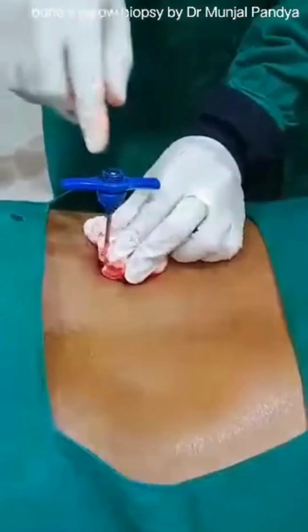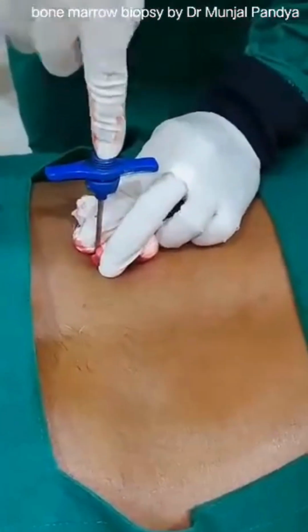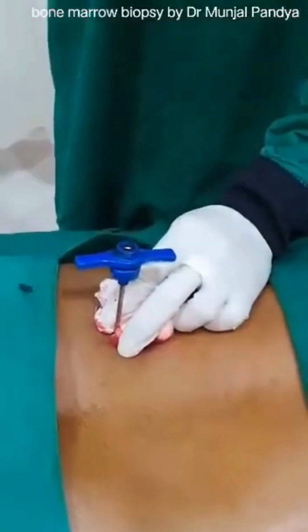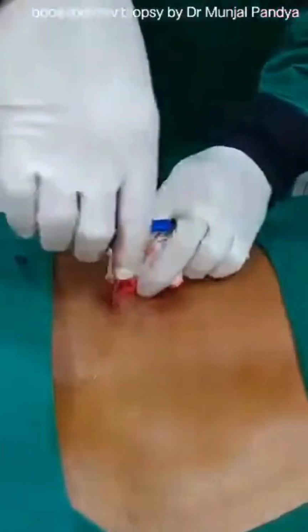Now if we want to do the aspirate, we'll directly attach the syringe here and withdraw the marrow material, that is aspirate. But now I want to take a trephine.